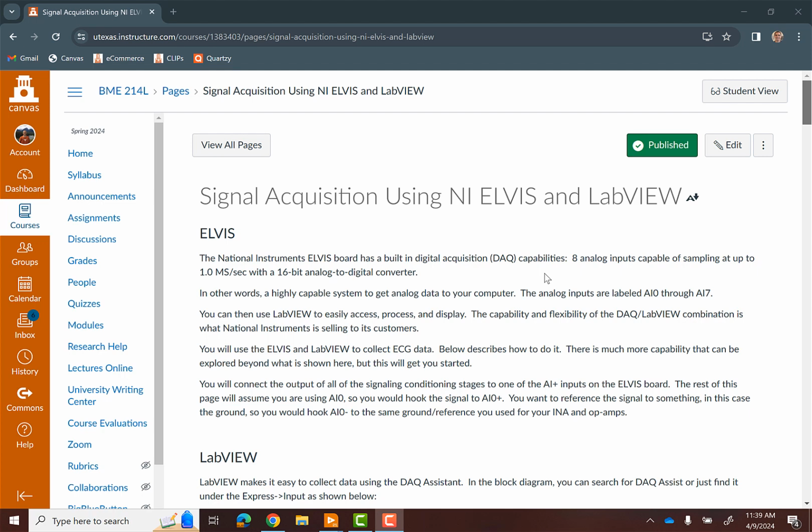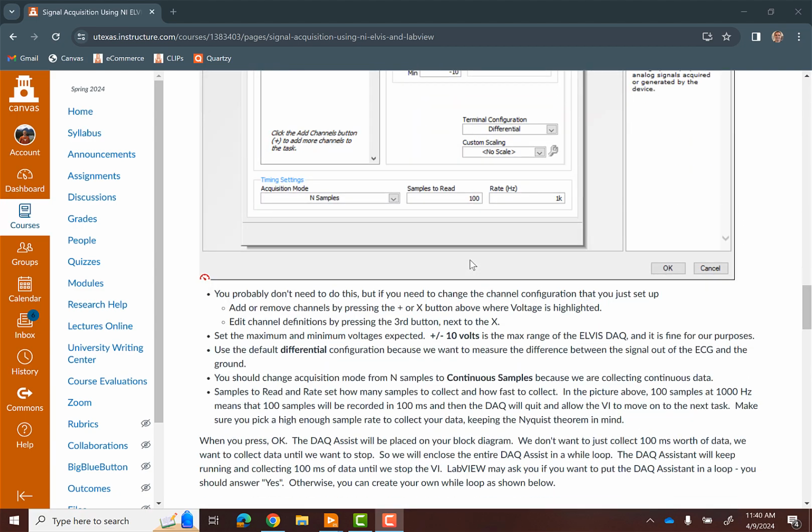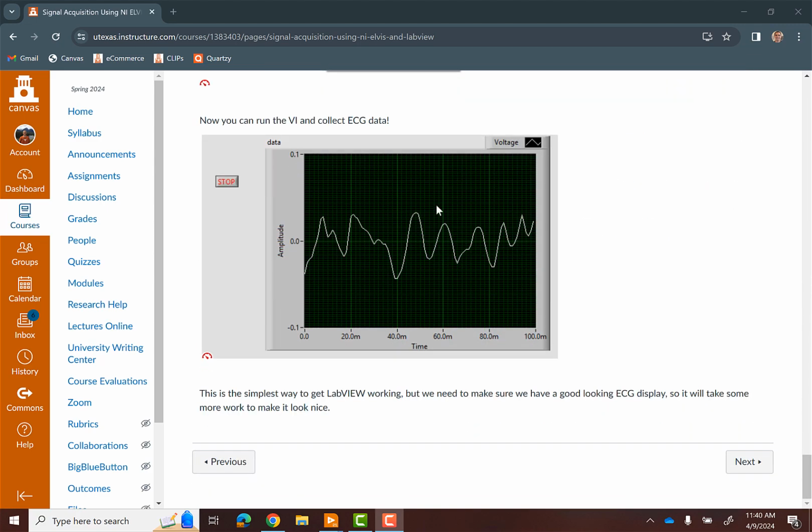Dan here. Our last thing we have to do for our BME 214L ECG project is to make a nice display that is useful, right? Rather than just using that dynamic signal analyzer. So we're using LabVIEW to do it. I put some background information on Canvas about LabVIEW. You can go through as much of that as you need, but we're going to build a LabVIEW VI to display our ECG data. And so I gave some direct instructions on how to quickly get a LabVIEW VI working so you can get a display.